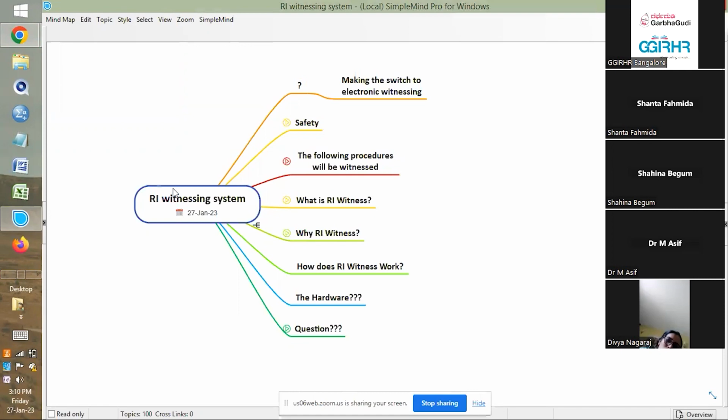For that reason, this RI witnessing system is very, very important. The RI witnessing system is nothing but a switch to electronic witnessing. Humans are better than electronic witnessing in some ways, but still humans make a lot of errors because of a lot of information.